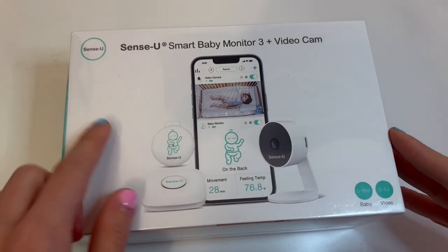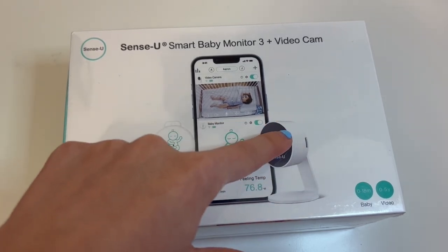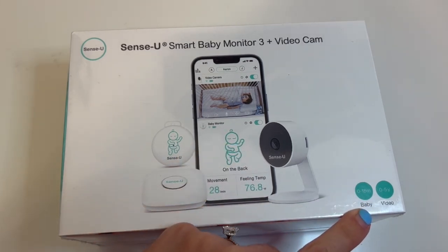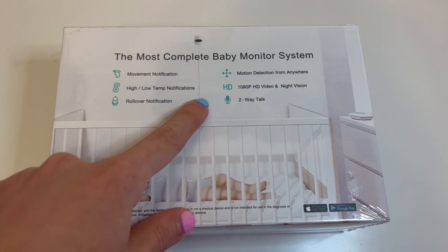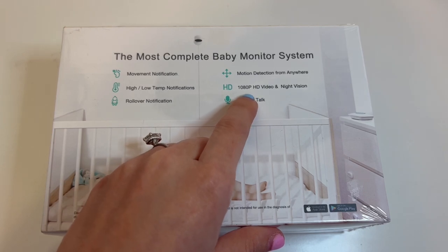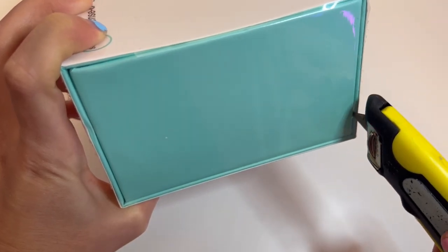Here it is — the SenseU Smart Baby Monitor 3 and video camera box. You can see there's an app for this device, there's the device you put on the child and the base station, and there's the camera. You can see the movement of the child, the feel temp, and what position the child's in. This is good for a baby 0 to 18 months, and video is good for 0 to 5 years. Looking at the back of the box: it says the most complete baby monitor system. You can see movement notifications, high/low temp notifications, rollover notifications, and motion detection from anywhere. It has good quality video, night vision, and it's two-way talk so you can talk to and hear your child.